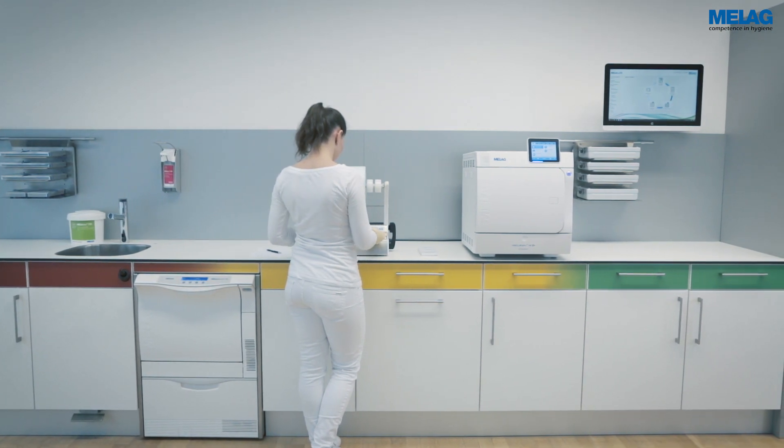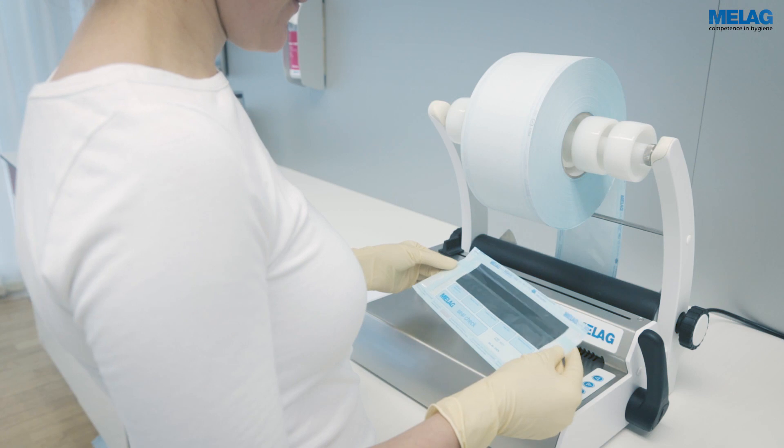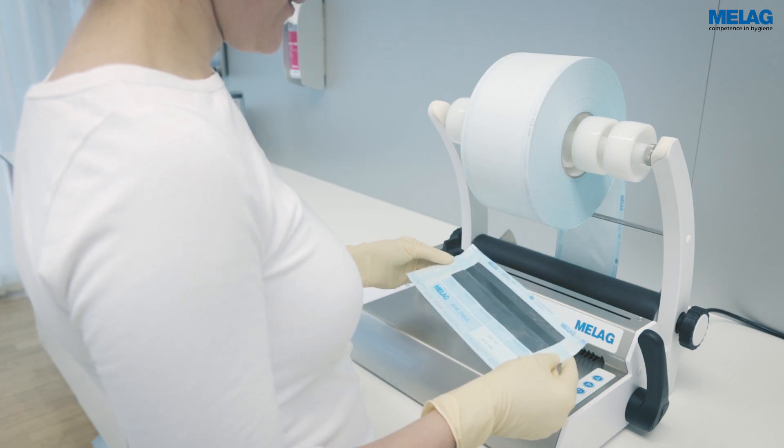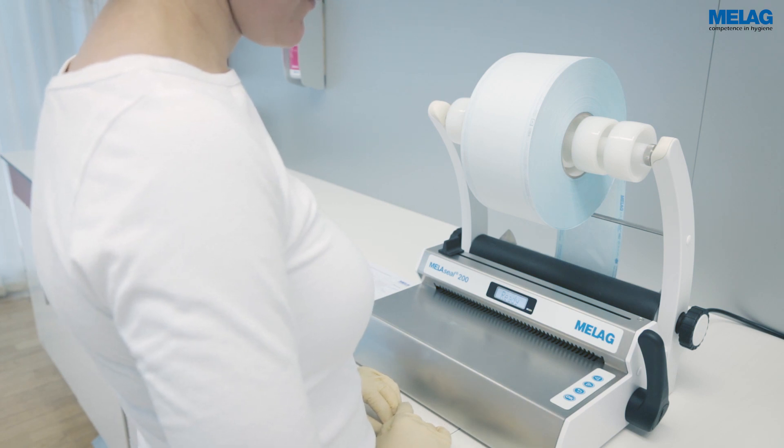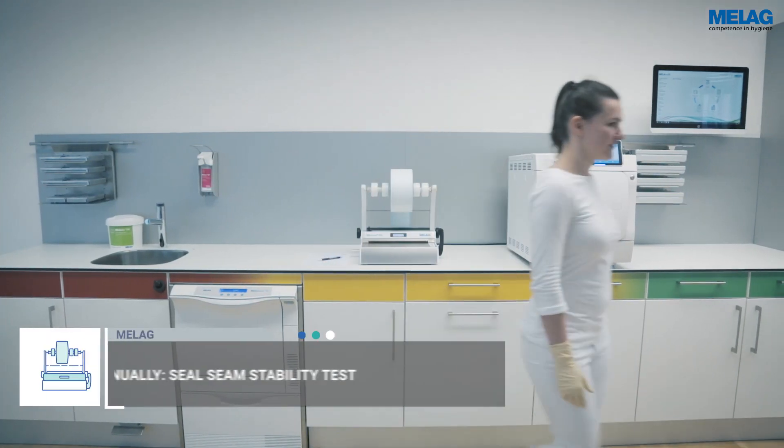The seal seam on the test field must be free of wrinkles and bubbles or any further irregularities. The routine checks are completed by the annual seal seam stability test.